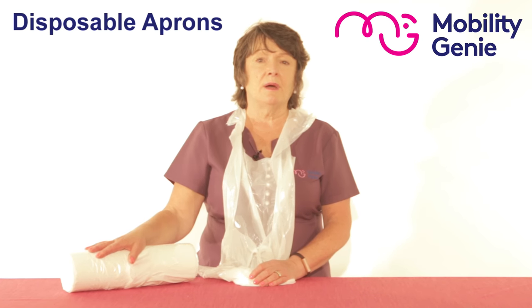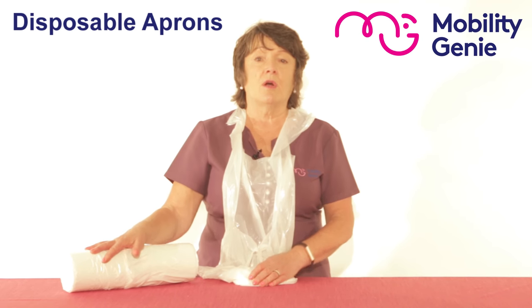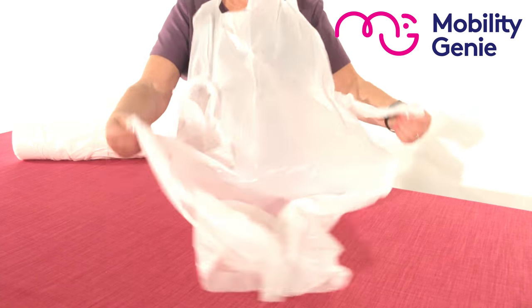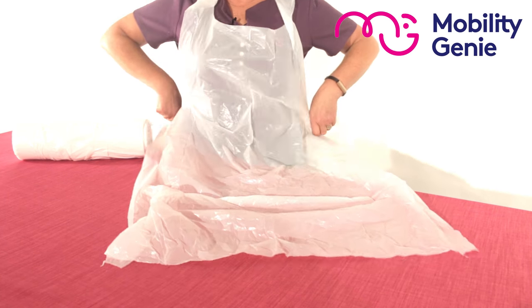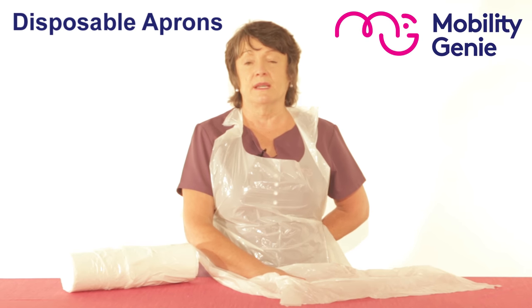You have 200 polythene aprons on a roll that offer instant lightweight protection from infection during care and medical procedures or cleaning tasks. It's simply an apron that goes the full length to the knee and just straps around the waist nice and neatly. So these are your disposable plastic aprons.